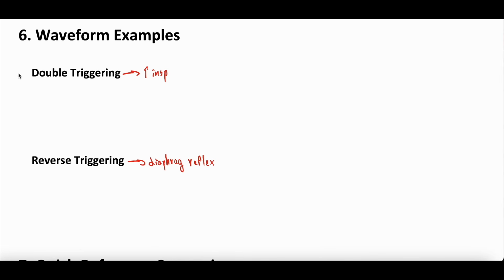So we're going to do these scalars based on volume control. And the scalars are waveforms, right? There's pressure versus time, flow versus time, and volume versus time. For the sake of room, let's start with the pressure scalar here. The pressure scalar normally looks something like this. So it's pressure and time. We've had a bunch of videos on scalars, so check those videos and episodes, both podcasts and YouTube, on the playlist.